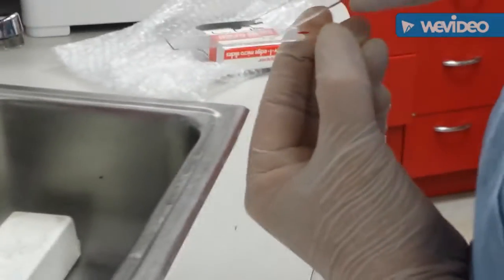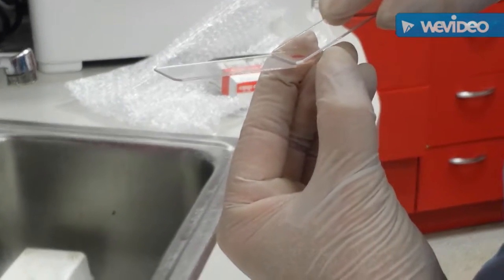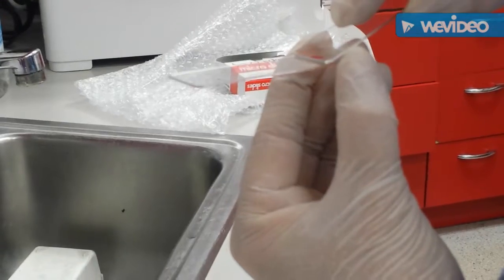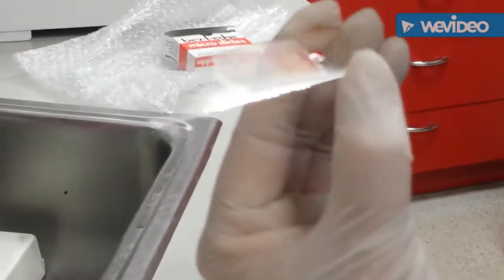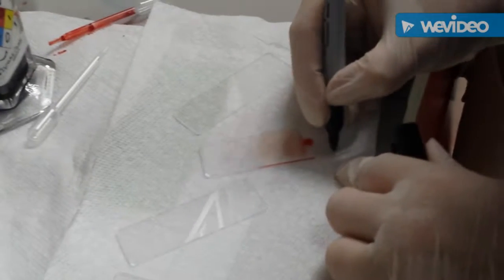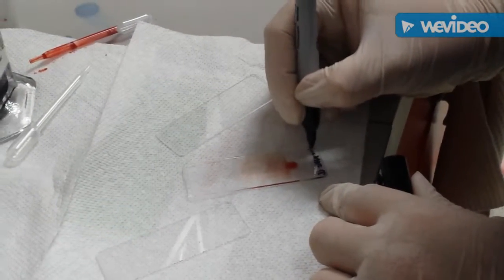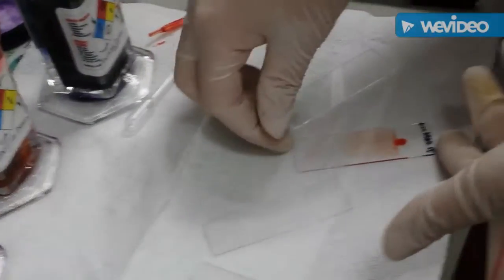And then we are going to bring our slide back and let it absorb the blood just all the way across. And then without lifting, we want to slide it forward. And so we're going to place our slide, we're going to label it with JJ's name, his ID number, and today's date. And then we'll place this butt down up here to dry.